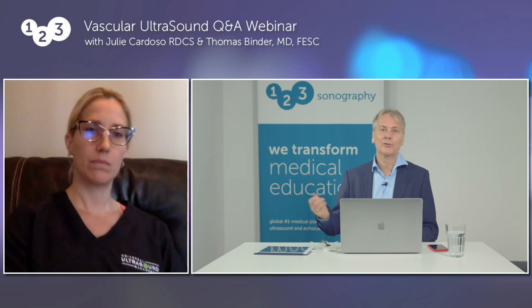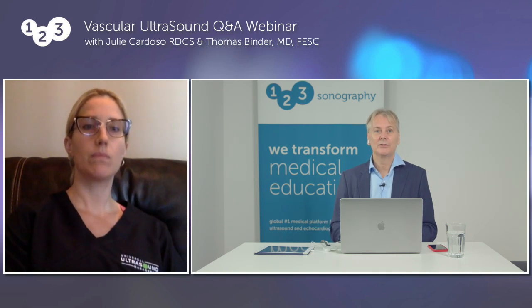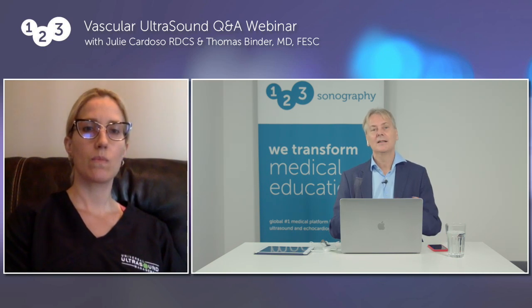Mm-hmm. Just a question for me again as a cardiologist, what we are always very much aware of is that if we perform catheterizations either from the groin through the femorals or maybe from the radial artery, it's always the issue of fistulas, but it's also the issue of hematomas. And one of the things that is being used to treat these is just compression with a transducer. Can you just comment on what your take here is and when this makes sense and what the indications are maybe to go towards surgery?